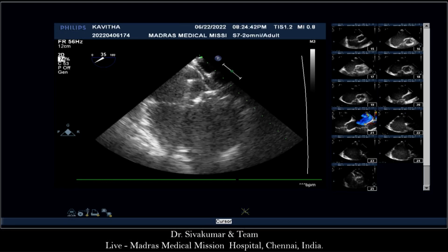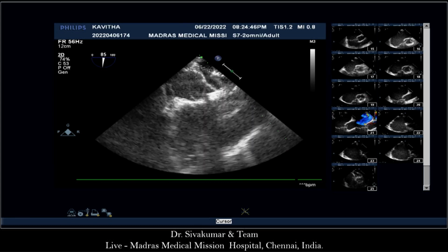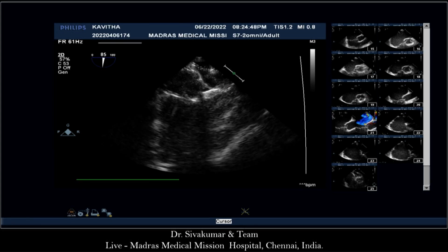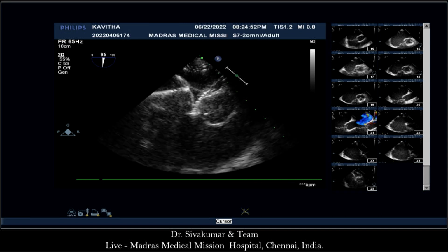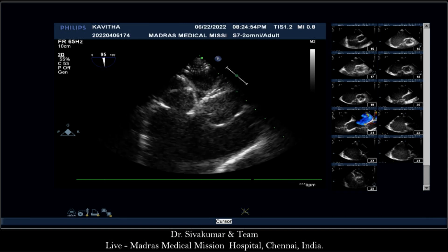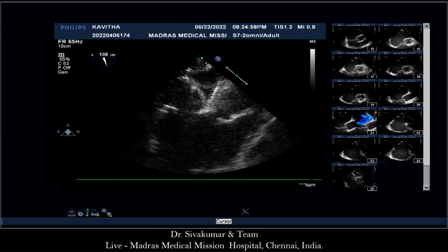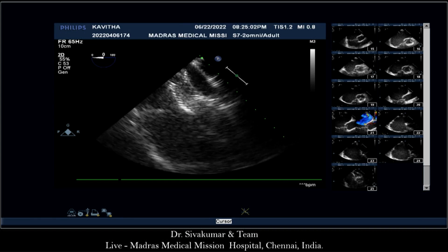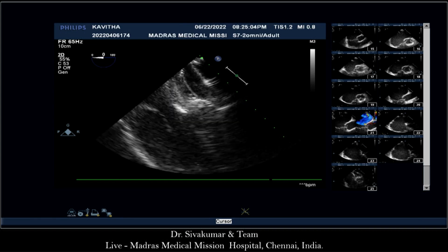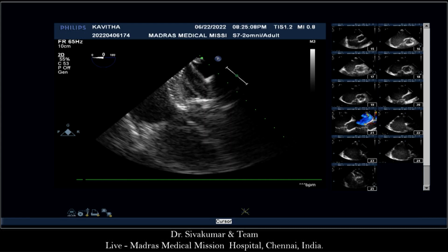Transthoracic apical view. Can we stick with the transesophageal, because I think we do need to get this mitral valve sorted. We have to look at the mitral, and you may have to suction this out because there may be too much saline there. That's where image is ugly, so sometimes that helps a lot. But I would look at four chamber view, 0 degree, get rid of the aorta, see the mitral. Srija, leftward rotate and push it some inside. For some reason, the view is not coming.